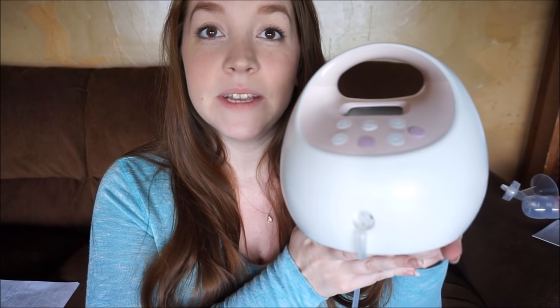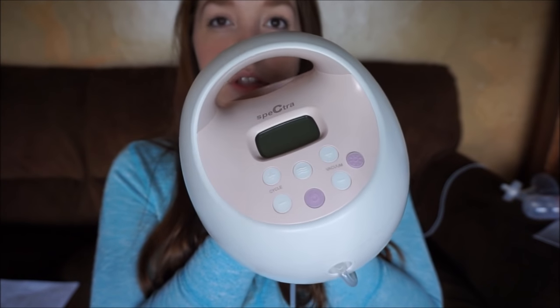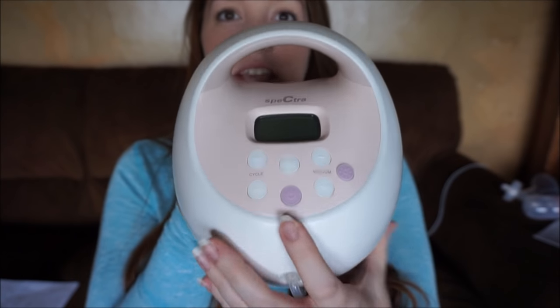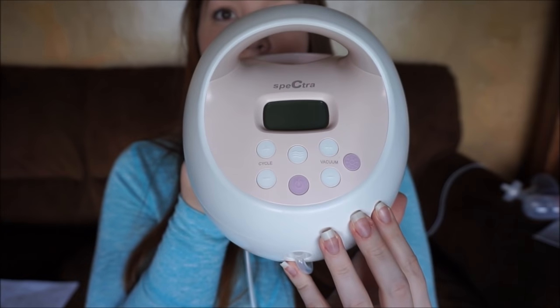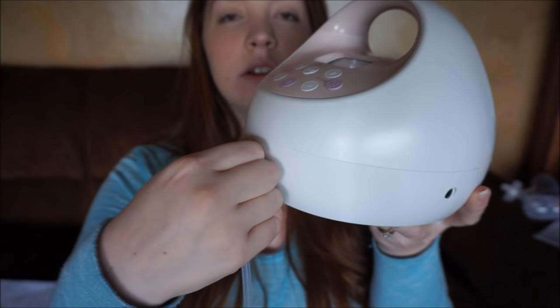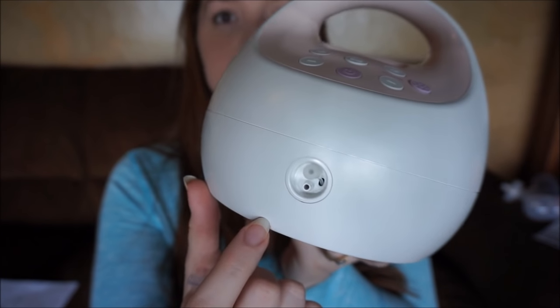I've been talking for a while and totally spaced out and forgot to show you this part, so I'm just going to throw it in here. This is the pump itself. As you can see, it is beautiful — I love the pink color. It's got this nice little screen right here, and here are the buttons for it.